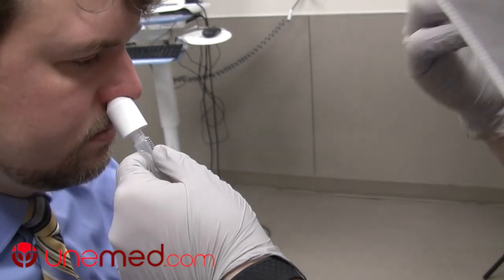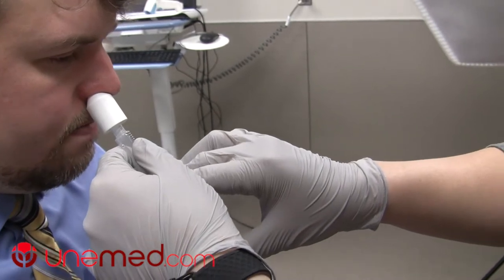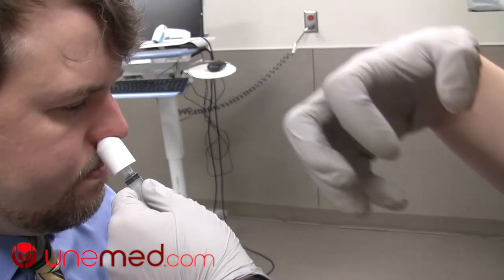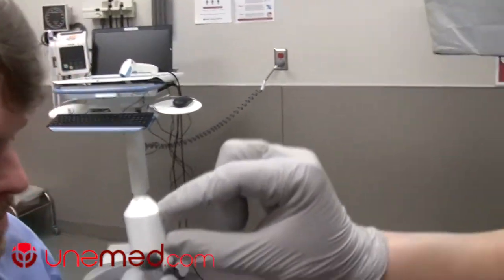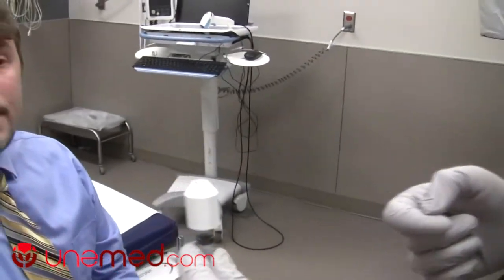I have the patient count to three — on three they take a deep breath and hold, then I irrigate. As the saline goes in, it blasts back into their nasal cavity, collecting debris from the pathogen of interest. Then they hold as it drains back into the device. We cap it off and send it to the lab for testing.